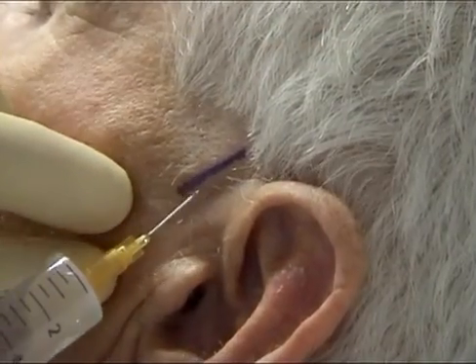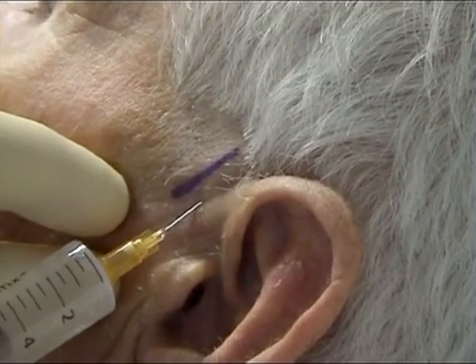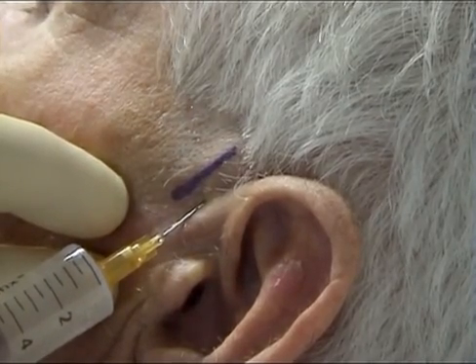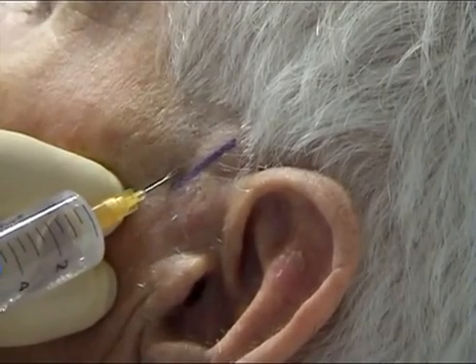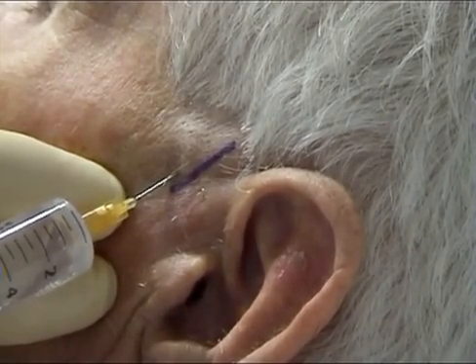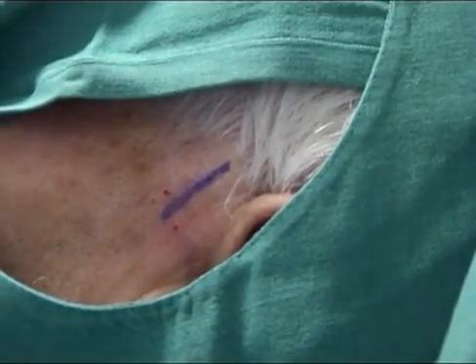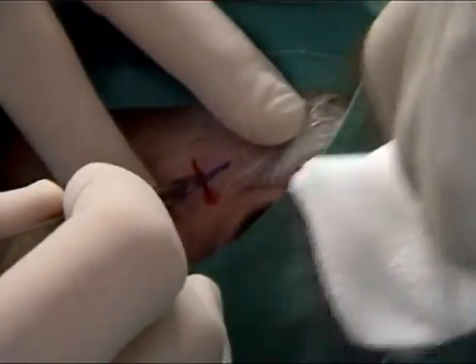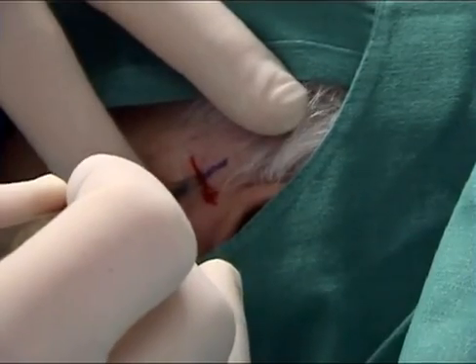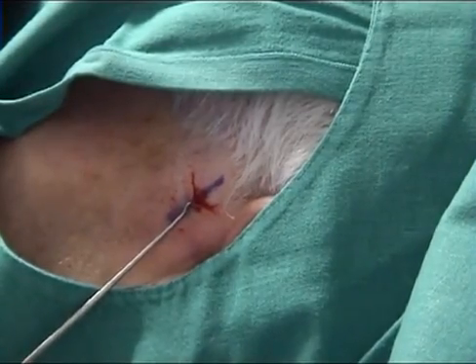First, local anaesthetic is infiltrated. A one centimetre skin incision is made and retractors are placed.